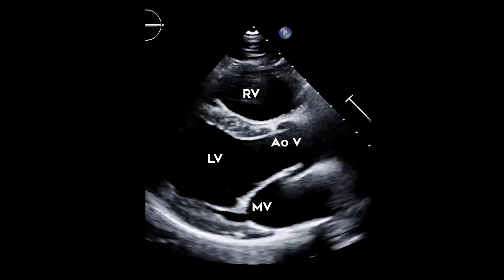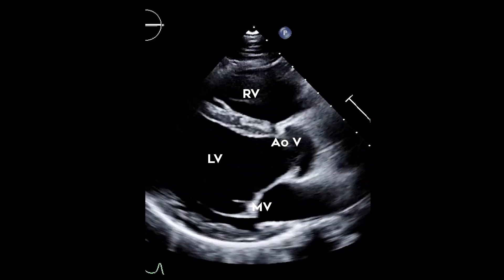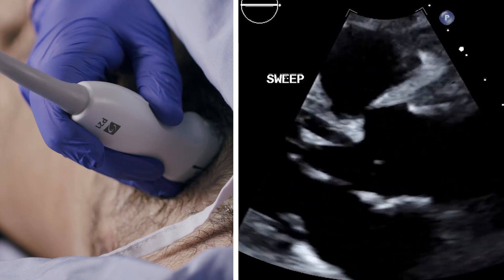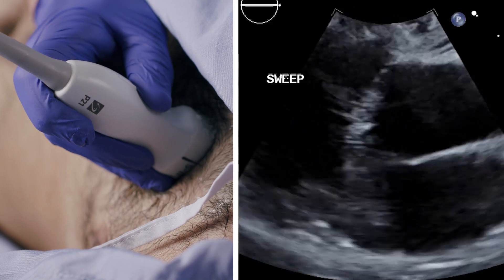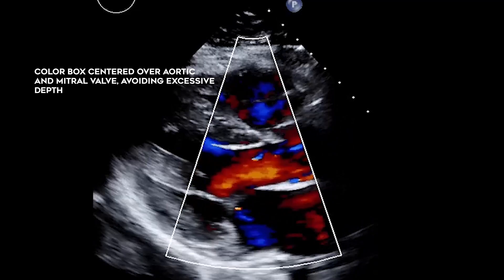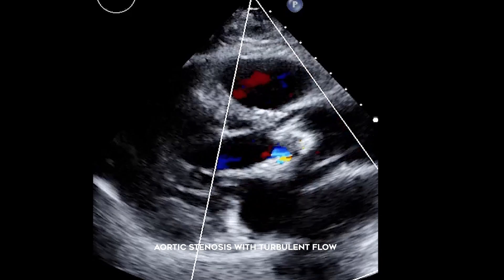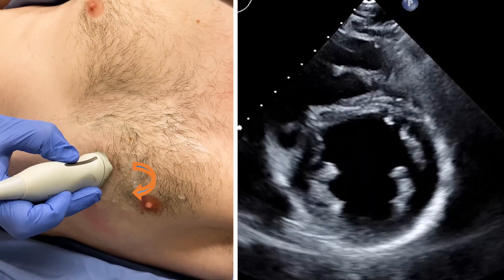Now let's turn our attention to the valves. We see the mitral and aortic valves from the parasternal long axis view. It is possible to tilt the probe and sweep through the mitral and aortic valves in a medial to lateral plane for a more comprehensive assessment. I will show how to position the color box in relation to the aortic and mitral valves. Turbulent flow can indicate valve dysfunction such as stenosis or regurgitation.